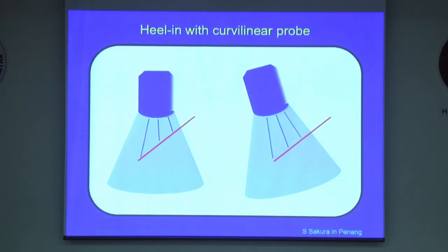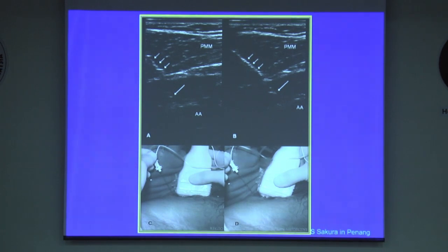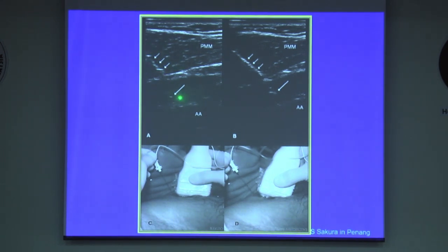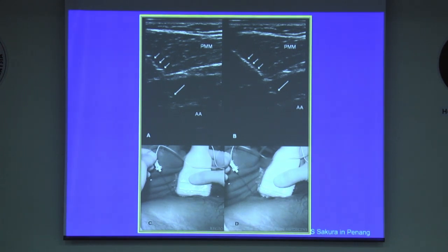You can use this heeling maneuver when using a curvilinear probe as well. If you tilt the probe like this, you can image a needle passing at a steeper angle better. These images show the infraclavicular brachial plexus block — the needle is inserted at a steeper angle. With the normal technique, the needle shaft and tip cannot be seen clearly. But by pressing the caudal end of the transducer more deeply into the patient, you can increase the needle-beam angle to see the needle better.